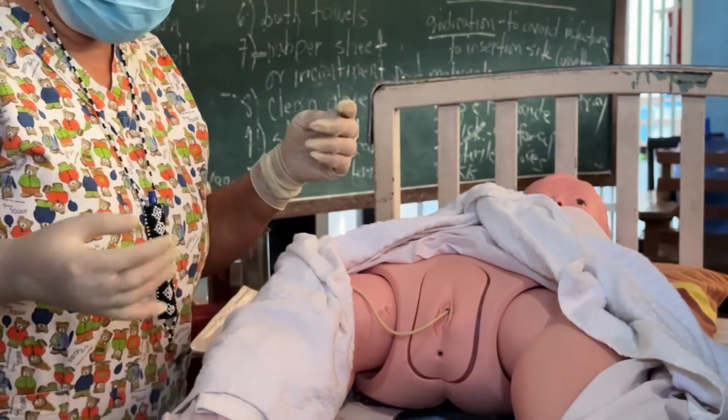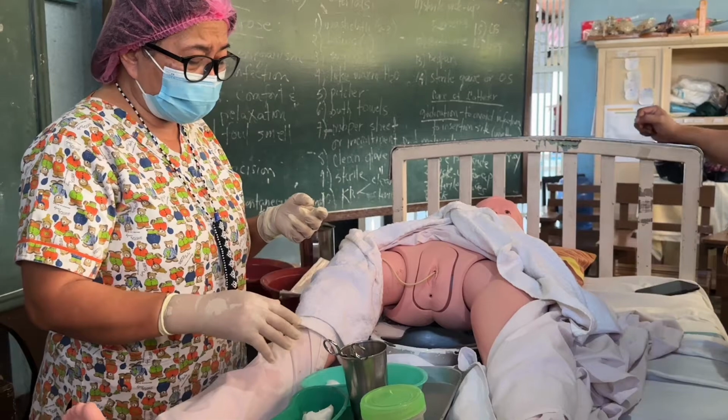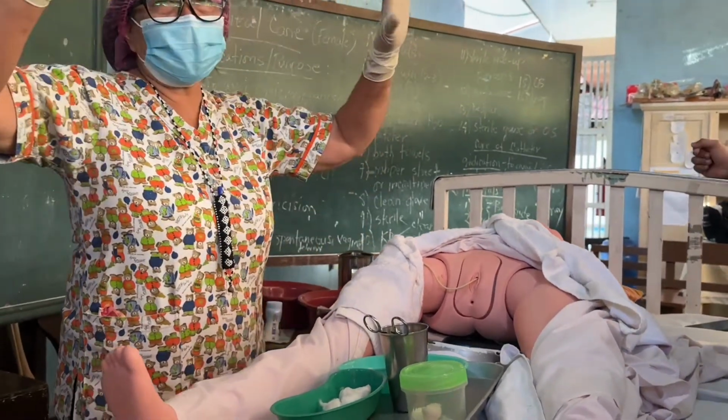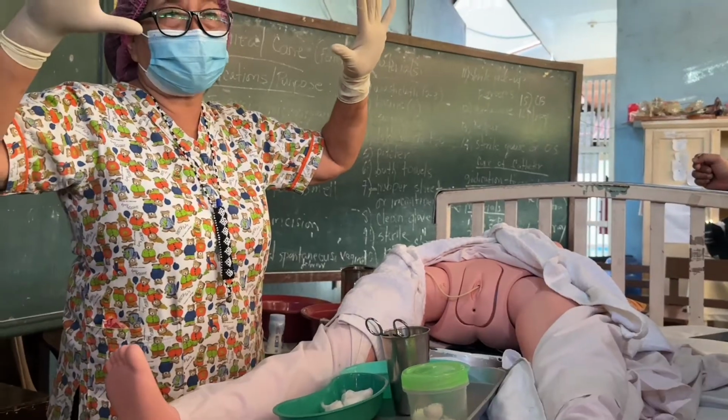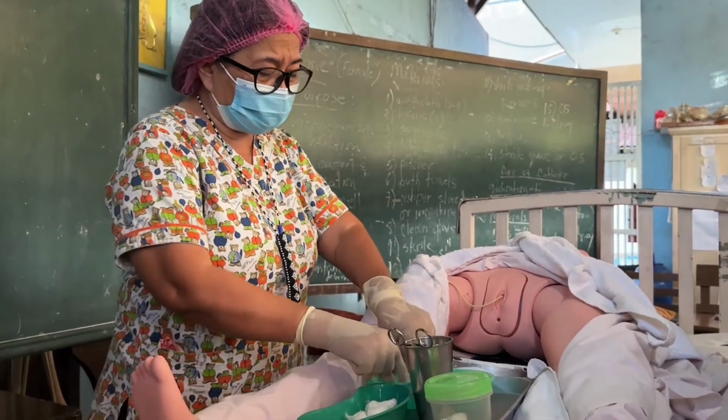Okay. So, prepare all the materials, sterile cotton balls, then you pour betadine. Then, I have changed with a new set of sterile gloves. Okay, I have changed with a new set of sterile gloves. Then I pick 2.